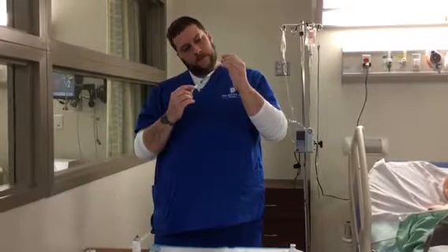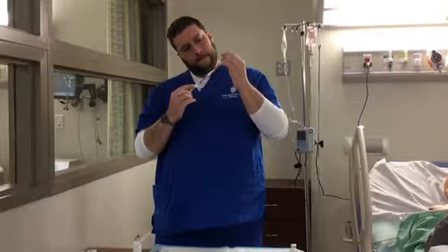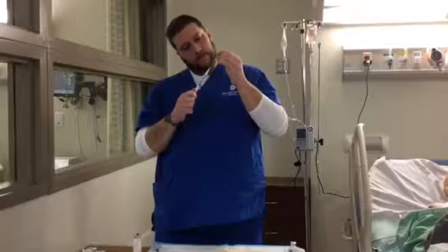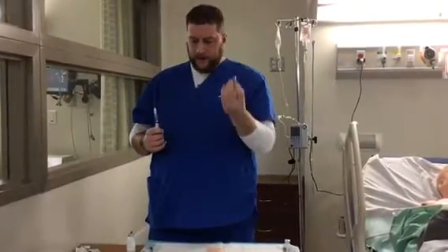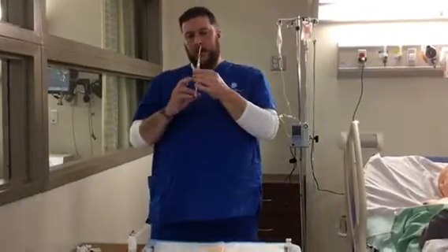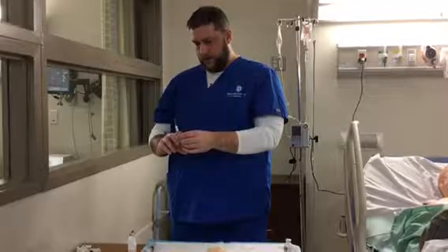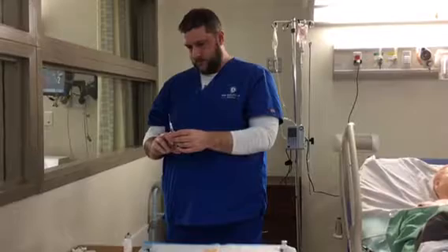Towards you, so the stuff goes away. Towards me, but away. No, towards me, like this way. I don't know, show me. I was having a hard time with it, so I was pulling this way, that way. At this point here, the glass would be discarded into the sharps container. I would have this over the trash can. I don't care.